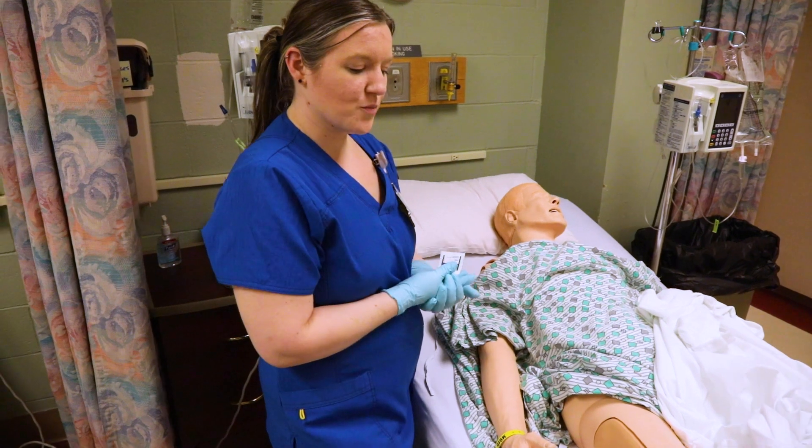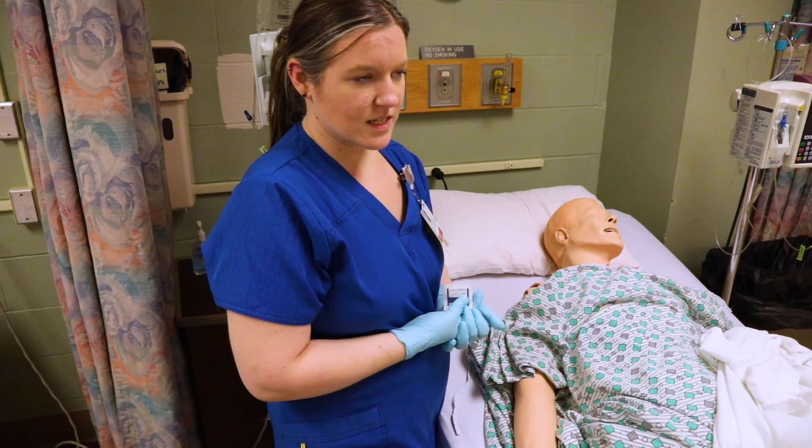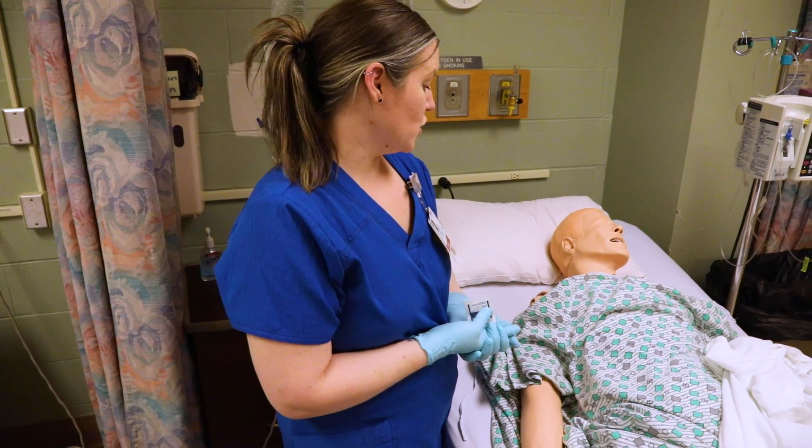I'm going to show you how to do an intramuscular injection, or IM injection. Always remember, follow the policy and procedure of your facility or your textbook, whatever your nursing instructor tells you to do.